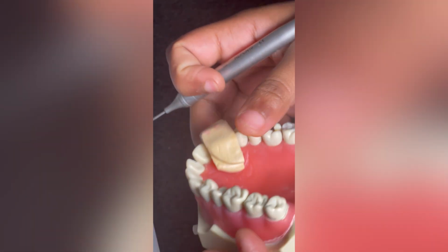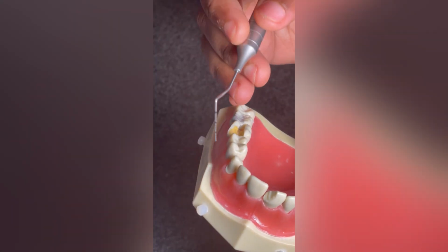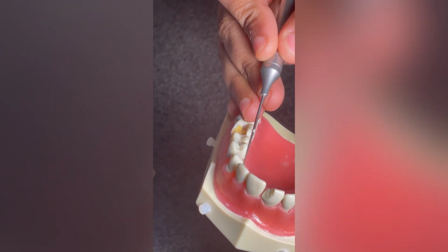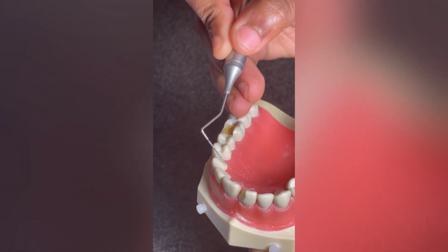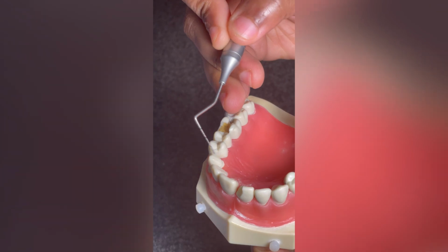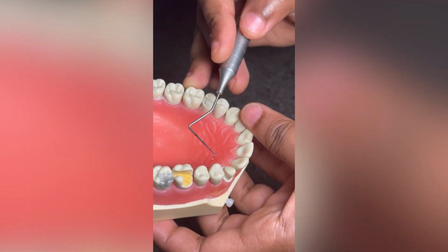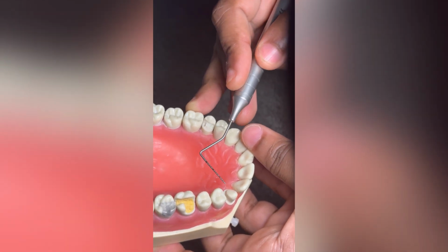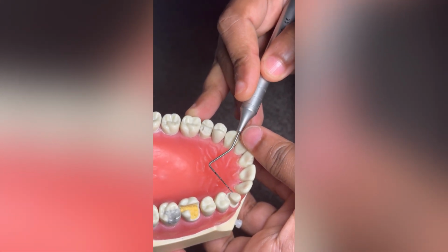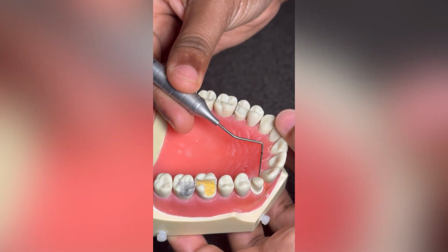Now line angles, all line angles are well rounded. Let's have a look. I could have rounded a bit more here, I can see a bit of sharpness here. Now checking the margin width lingually, let's have a look. I would say definitely less than 1 millimeter. Make sure to stay behind the first black line.